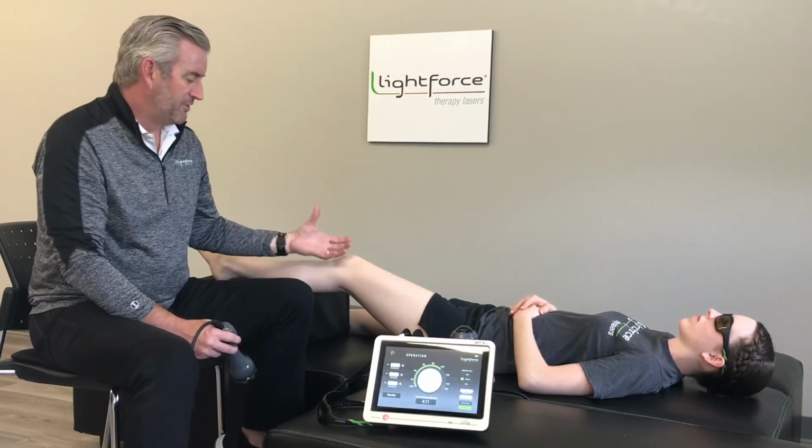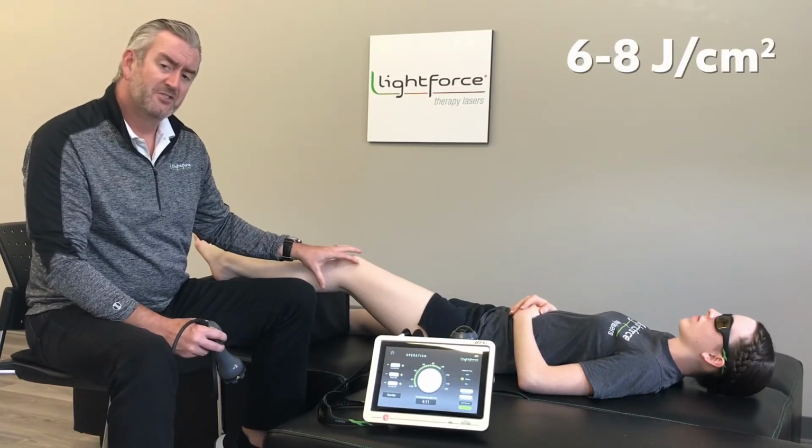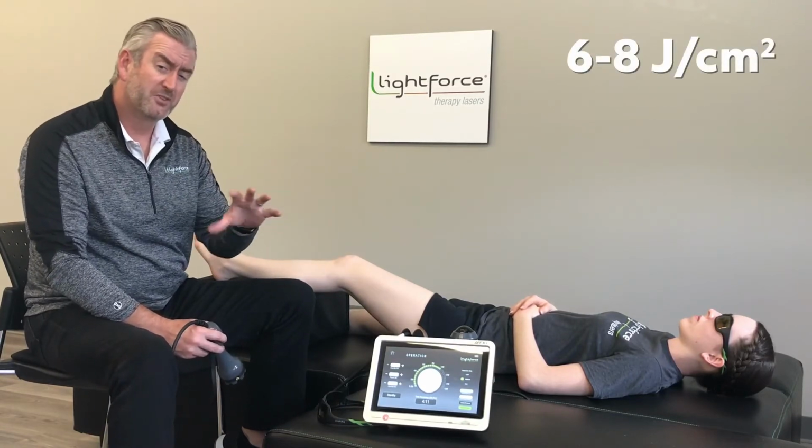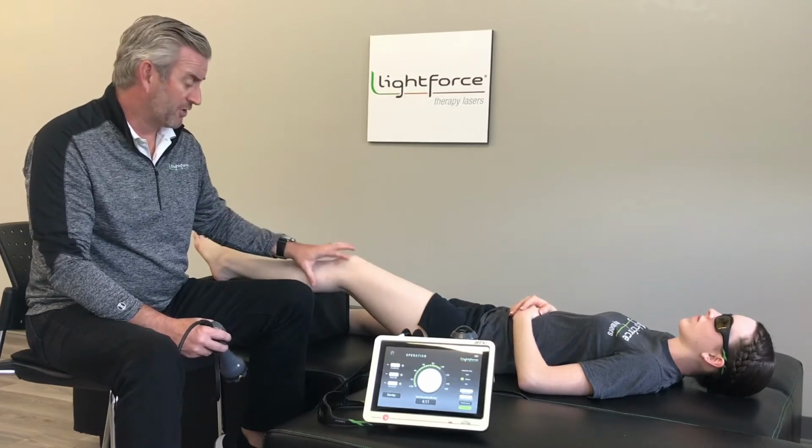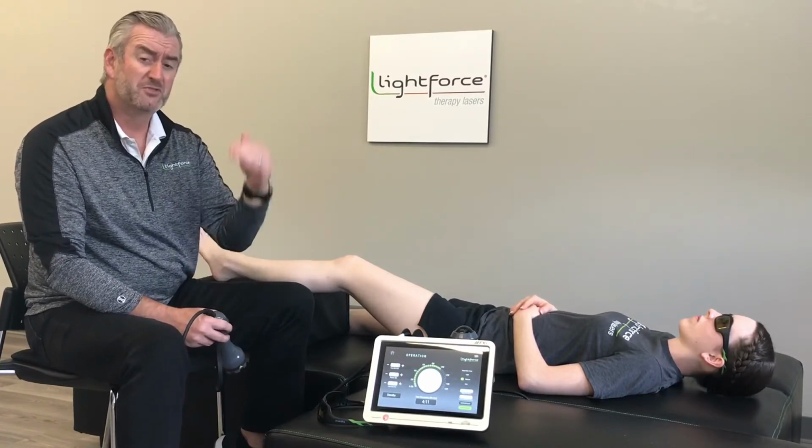So that's for your acute patient, 6 to 8 joules per centimeter squared. Power is going to be somewhere in the 6 to 10 watt range when using our equipment. For more chronic pain, you're still going to try to address the same synovium. You're probably going to do the exact same calculation if you have a chronic arthritic type knee, but you're going to try to use higher power in that case. The higher power is going to help reduce pain quickly and might free up motion better. It just has a different impact on the nerves that are around that knee.